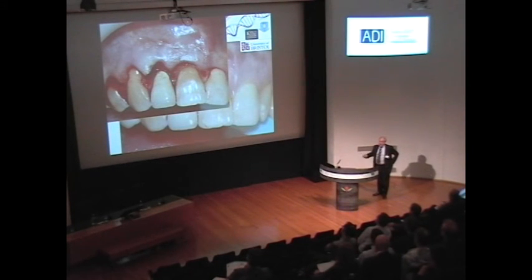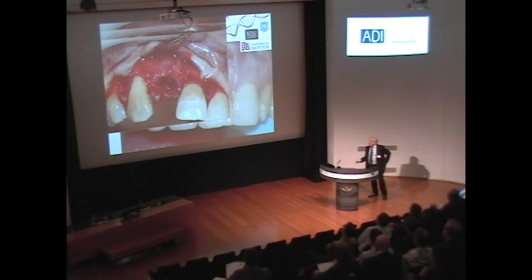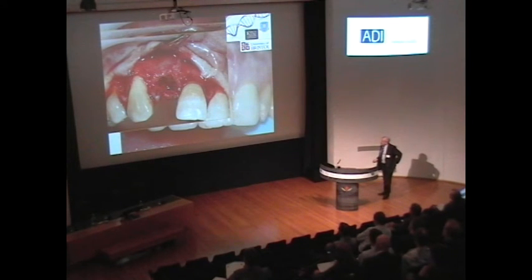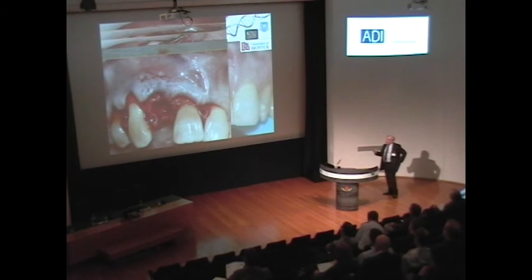So, you can go further and show what sort of techniques are going to be used for the same sort of things. Here is your labial plate. You've got little fractures occurring there. Implants up on the side. There's a bit of pocket lining pedicle at the back. We sew our connective tissue up underneath.